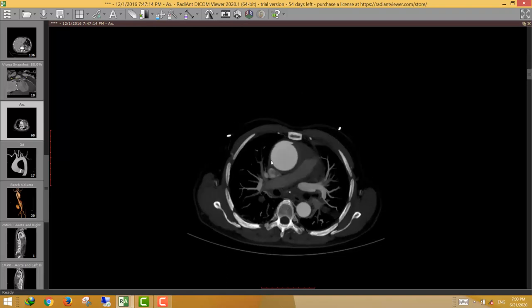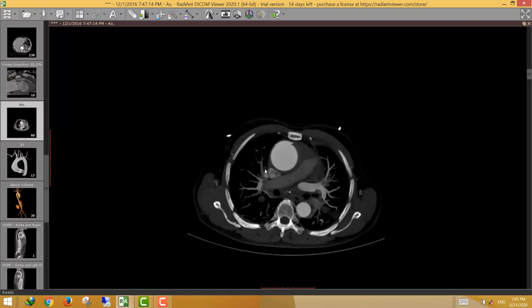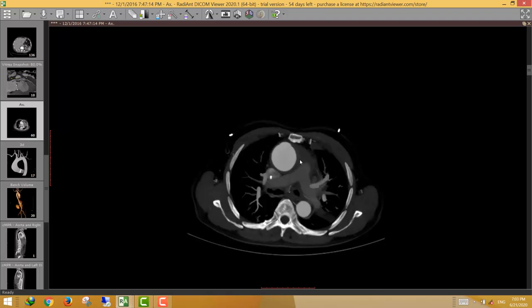On cross-sectional post-contrast axial images, we can see dilatation of the ascending aorta measuring approximately 5.8 cm — aneurysmal dilatation. An important finding is concentric mural thickening in the ascending aorta. This concentric mural thickening raises the diagnostic possibility of intramural hematoma.